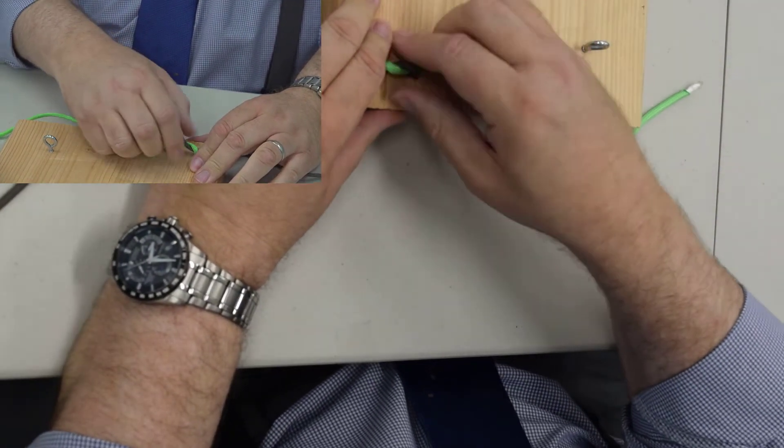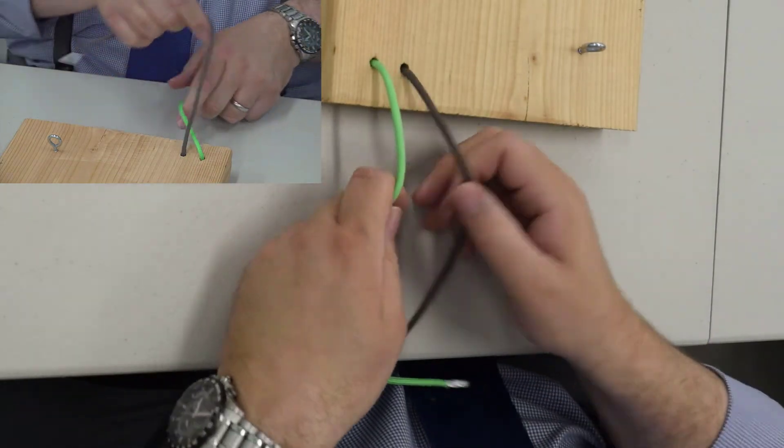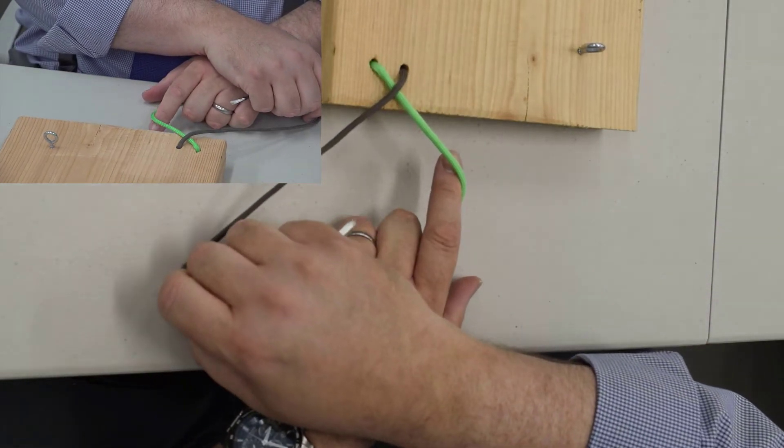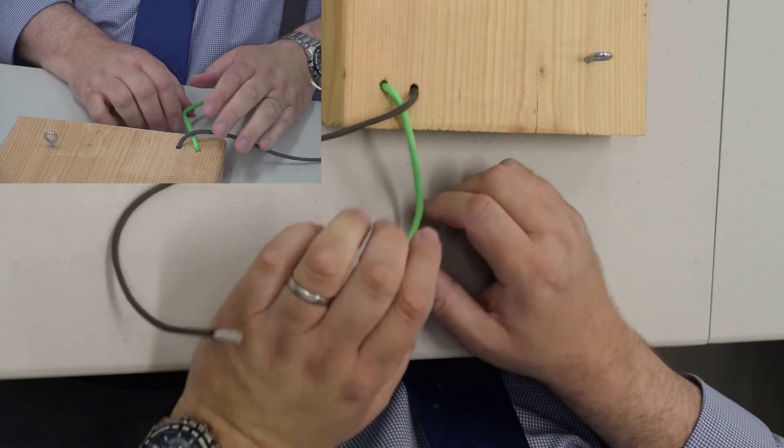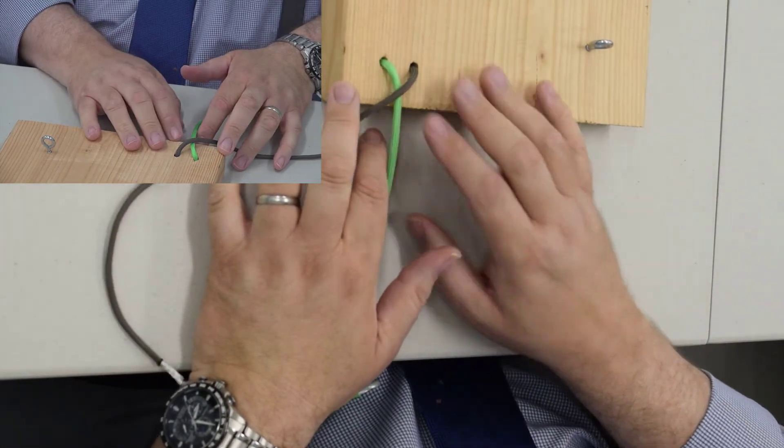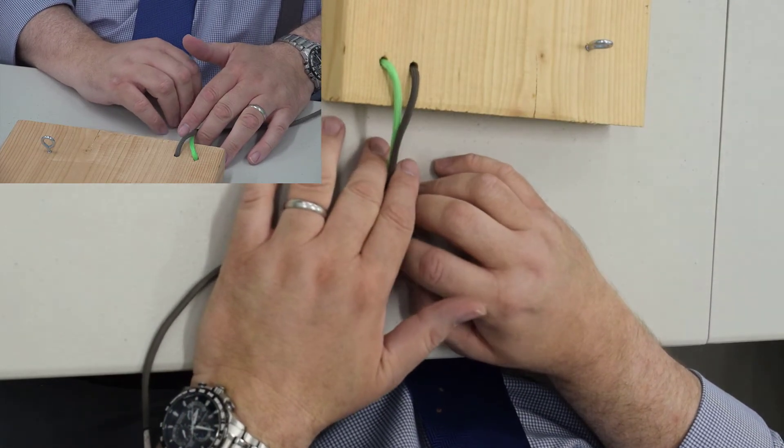So it does depend again on whether your green is on top or the brown is on top. Just like the one-handed tie determines which half hitch you're going to do. It's not a big deal. The more that you practice this, the more your brain will control for that, and you'll do it automatically.